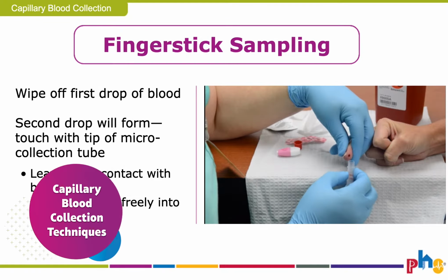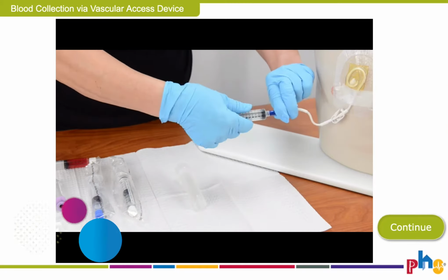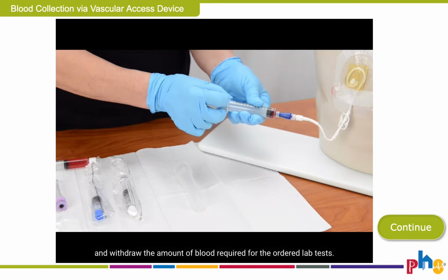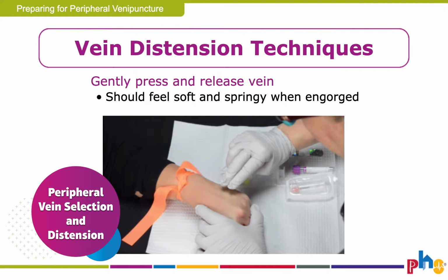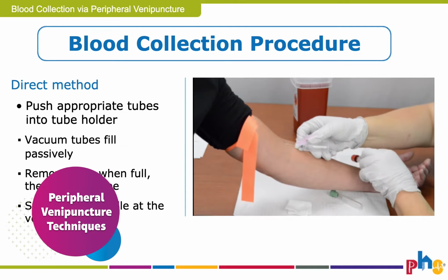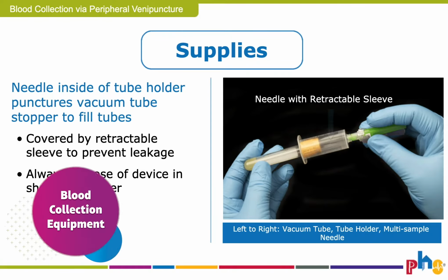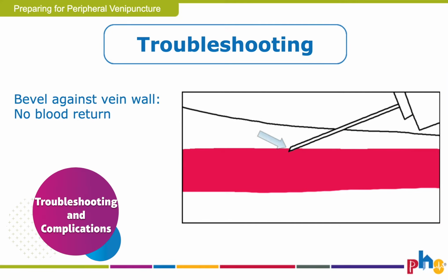capillary or fingerstick and heel stick blood collection techniques, central venous access device blood collection techniques, peripheral vein selection and distension, peripheral venipuncture techniques, appropriate blood collection equipment selection, and troubleshooting and potential complications.